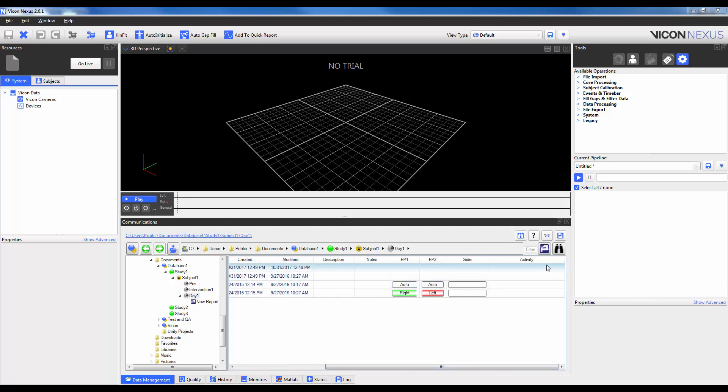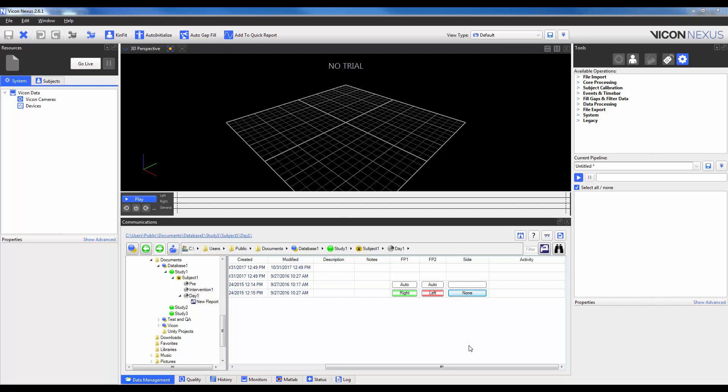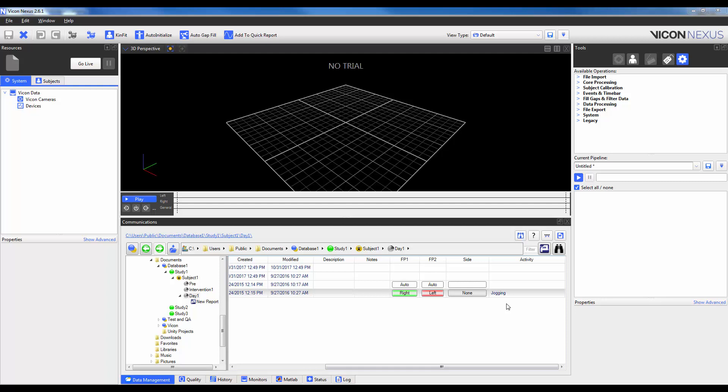And it'll show up as activity. So if I want to actually put in an injury side for one of my trials, I can just go ahead and click on the button. And you can see here it's toggled to left or to right or to none. So I'll just leave it on none. The activity, if I double click on that box now, I can see that I have an option to go ahead and select one of the different presets that I had set in the column types. So in this one, I'll select jogging. So now any column scheme or any database that we use with this column scheme will have side and activity added to it.